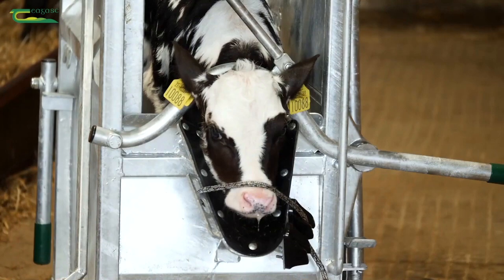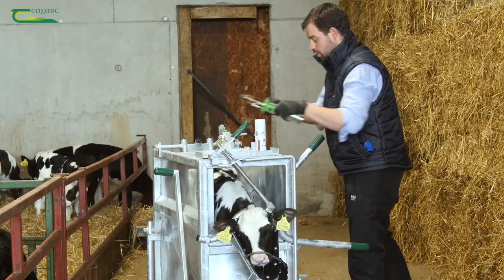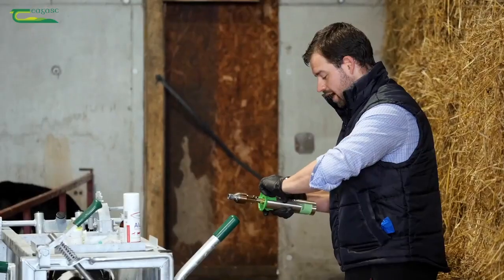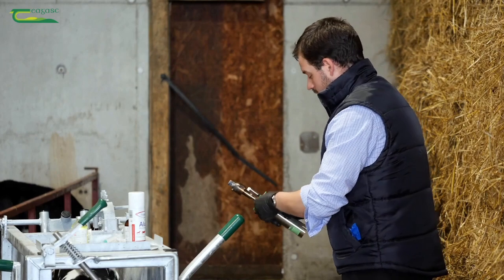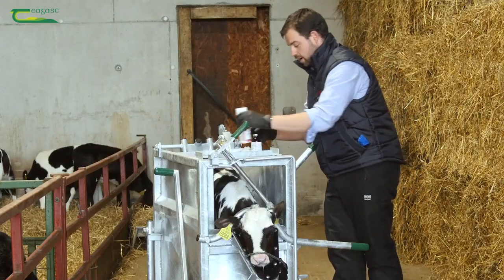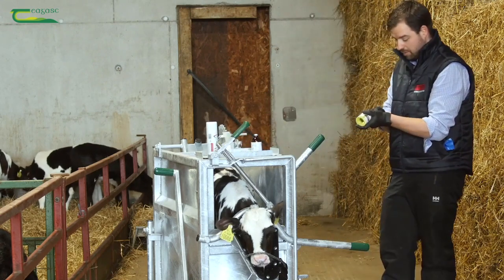Now that needs a bit of time to work. So while that is happening, what you can do is already start up your disbudding iron. Whether you're using an electric one or a gas one, they need to preheat. So start this up and let it get nice and hot. Keep it away from the straw, obviously. And what we're also going to do in the meantime is inject the calf with its anti-inflammatory.